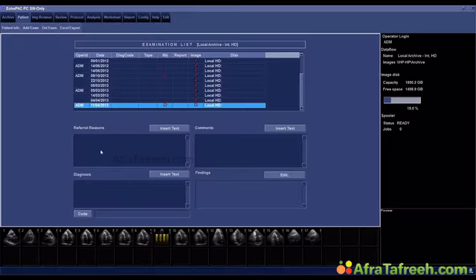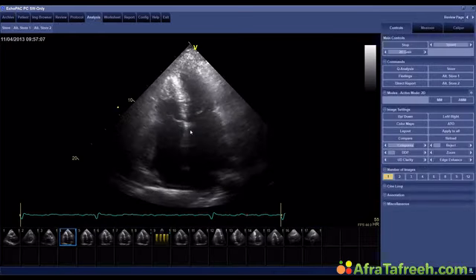Snowball. You can see the images right here. Okay, this patient came because she had atrial fibrillation and she was symptomatic, and after some time of trying all sorts of medications and cardioversions, we decided to try ablation. And before ablation, we performed an echocardiogram, and this was the echocardiogram we had at that time.